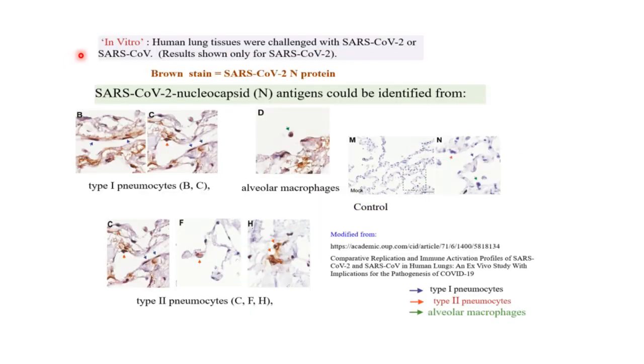These are the in vitro cultures of human explant tissues. That is to say, the tissue sections are taken from the patient and cultured in the petri dish, and they are explants so that they maintain the organ architecture. They are not cell cultures, so the organ architecture is maintained. Nevertheless, we have to be careful because certain controls that do exist within the body are not present in the explant situation. For example, these are not subjected to the normal immune regulation.